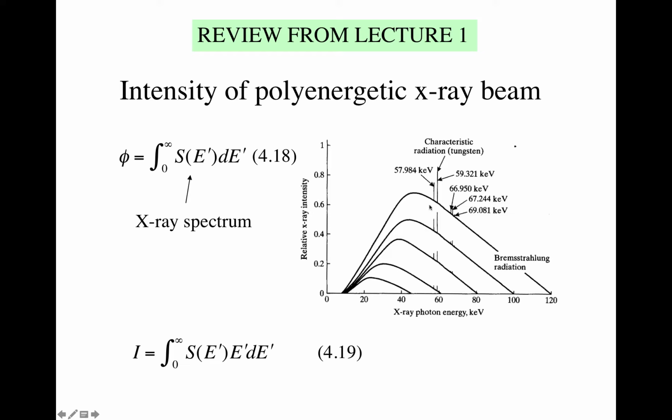It has a central peak, and when you're modeling X-ray imaging, oftentimes if you want to model a monoenergetic X-ray source, you would just take the mean of this peak. To say, okay, I can't really track X-rays at all of these energies, so for 100 kV, I'm just going to take the mean, which is here, like 50, and I'll do all my calculations there. Not a great assumption, actually, but reasonable for many purposes.